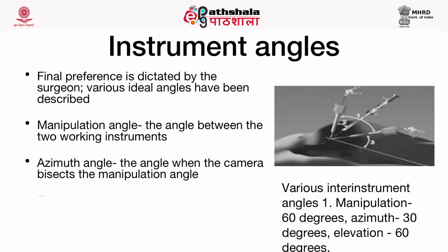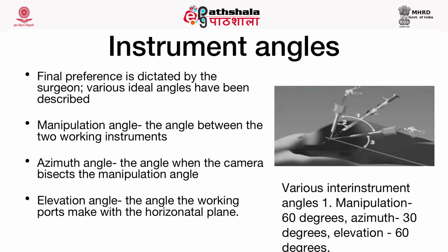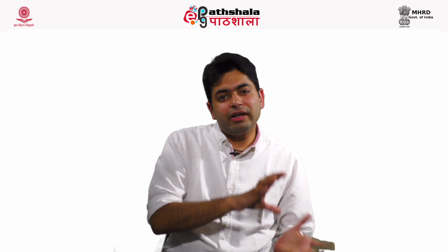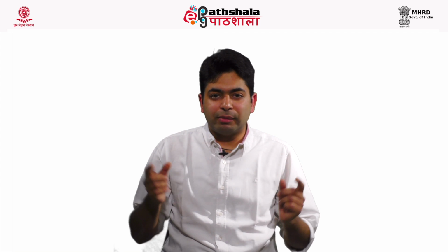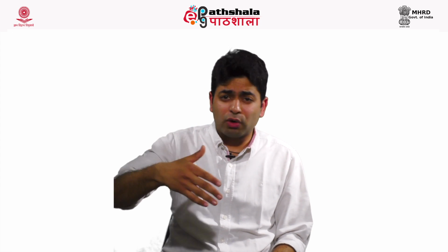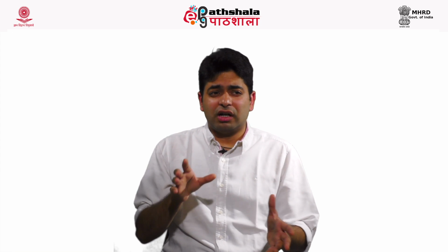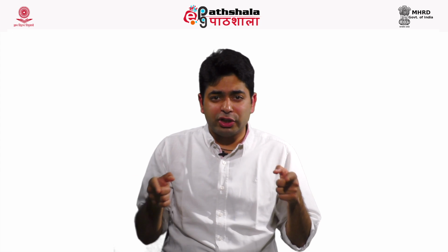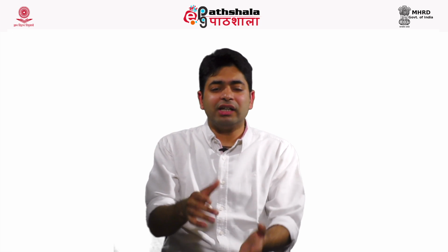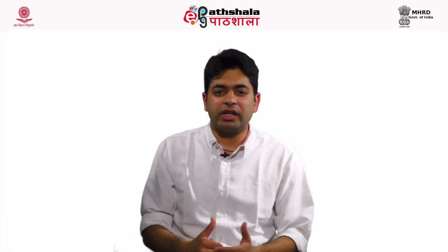And then another thing is called the elevation angle. Whenever the surgeon is operating, the angle which the instrument makes with the horizontal axis is known as the elevation angle. This is not an independent angle; rather it depends upon the manipulation angle. If the manipulation angle is 60 degrees, the elevation angle should also be around 60 degrees. But if the surgery is such that the surgeon needs to use smaller manipulation angles, say he needs to operate at 30 degrees, the elevation angle should also be 30 degrees.